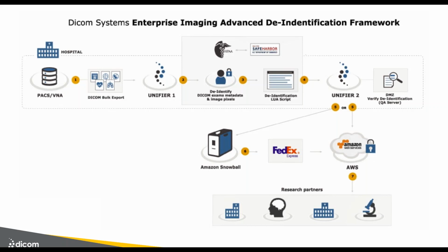For example, in this project, we excluded anything that a VIDAR scanner might have contributed to the data record, because that could literally be anything, right? And we're not at the level where we can apply OCR and artificial intelligence and recognize what constitutes PHI in a scanned document versus not. So if you're going to mass customize and massively de-identify lots of images like we did, 5.3 million exams in that one project, you can't potentially introduce some HIPAA violations by including scans that came from a VIDAR device. And so we excluded them.